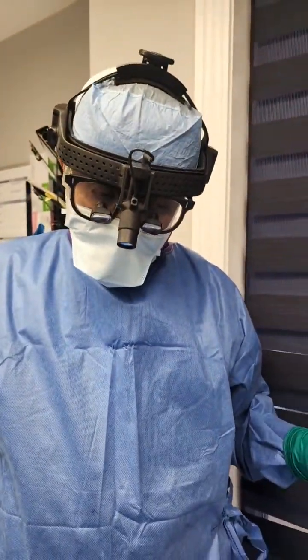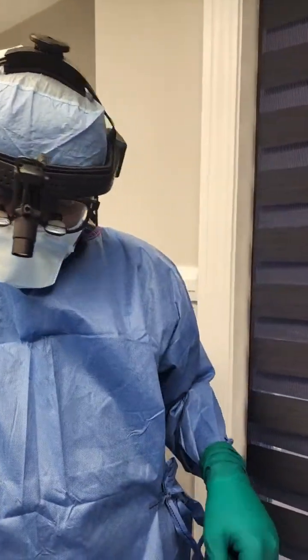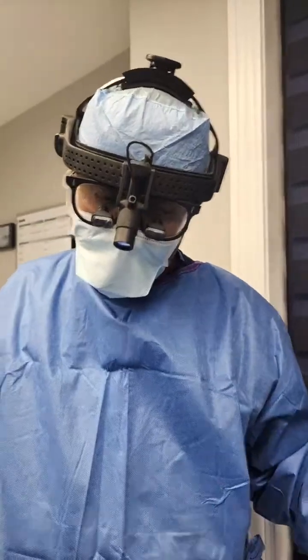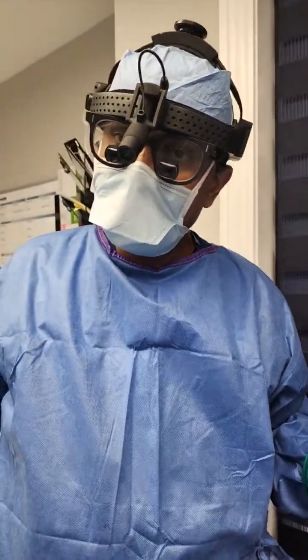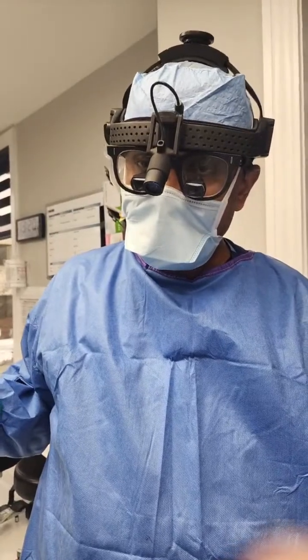Capsules will be sent right and left to pathology, rule out BIA-ALCL. Right intramuscular residual capsule scar tissue will be sent separately, and that scar tissue I'm going to send separately. So I'm going to have a total of 4 specimens to send to pathology. History of breast cancer on the left side. And then I'm going to take cultures for aerobic, anaerobic, and fungal, and most importantly, we'll see how the patient bounces back to a normal state of good health minus these toxins.